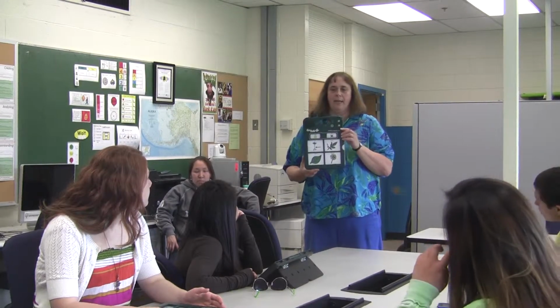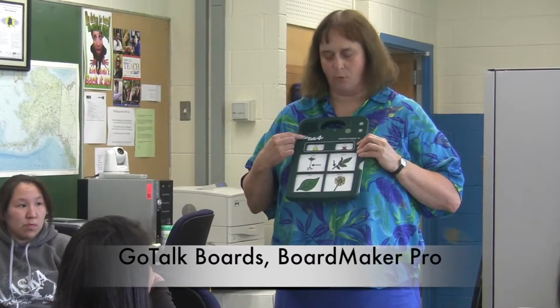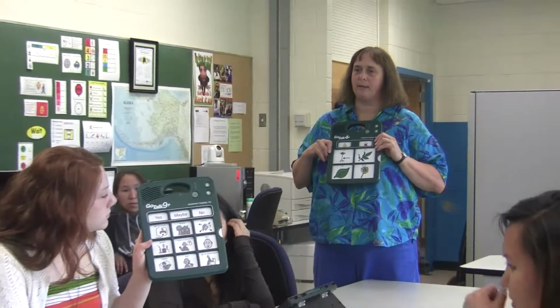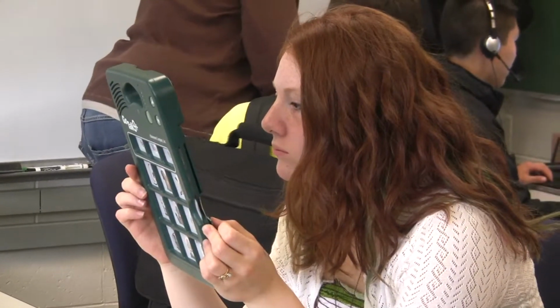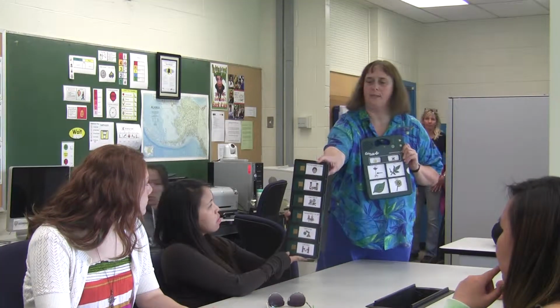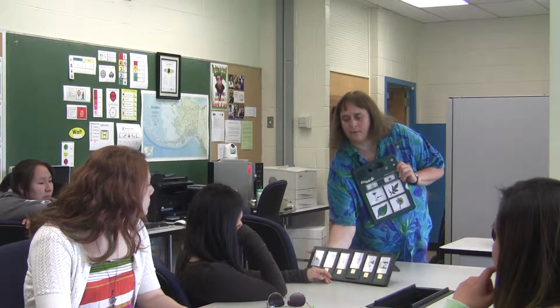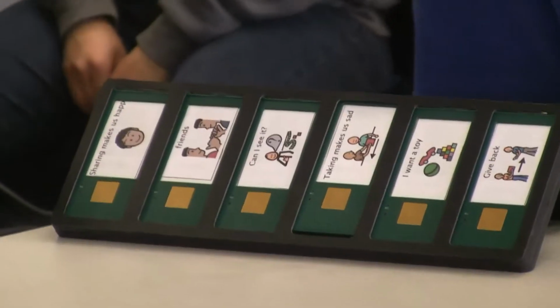Talk first. And the GoTalk comes in different sizes. This is called the GoTalk 4 because it has 4 main screens. And then if you want to hold up, you have a GoTalk 9, which is a little bit bigger, has some more capabilities, more communication. And then this one, actually we hold it this way. This is an individual one for students who may be in a wheelchair, and it has a tray so it can sit down on their tray. So I'm going to show you this one.